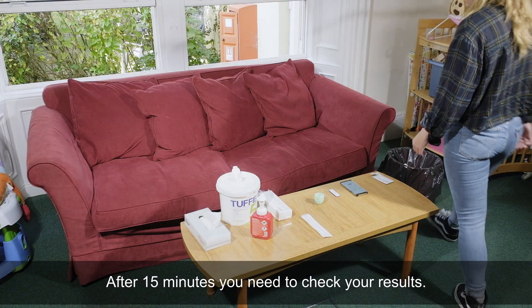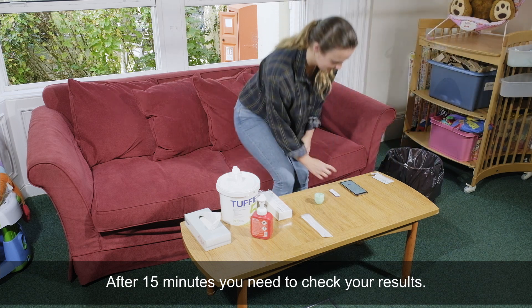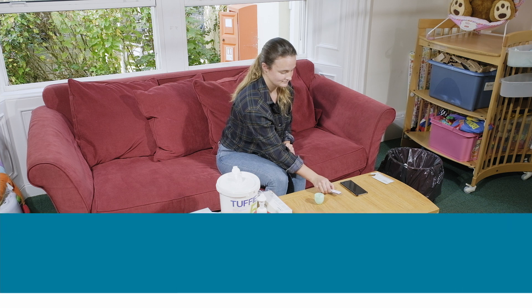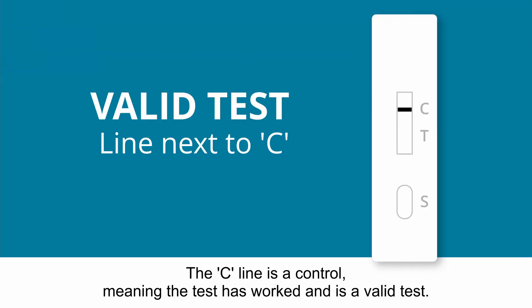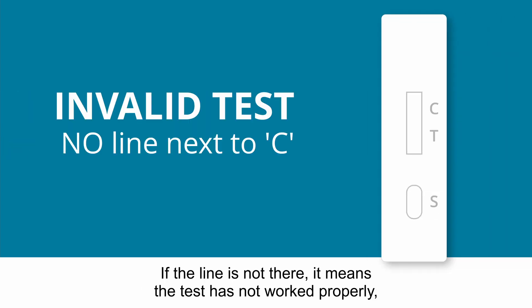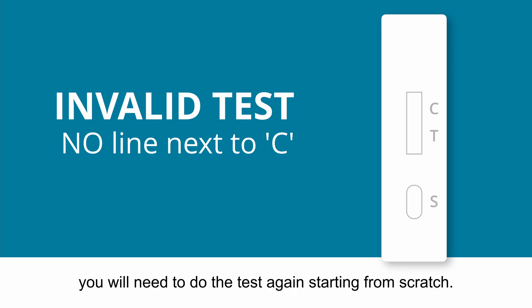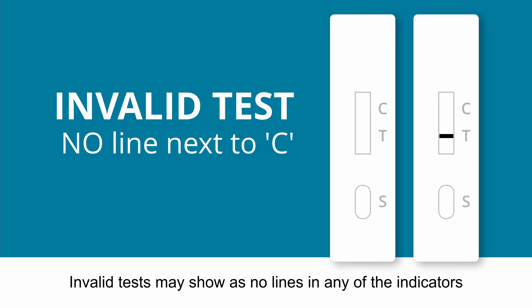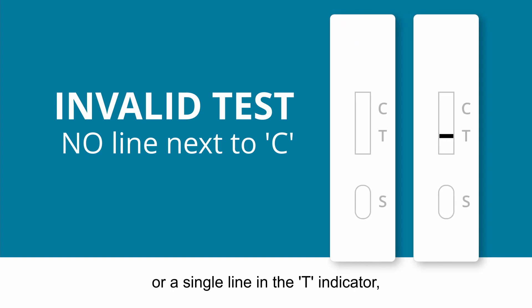After 15 minutes, you need to check your results. There are three possible outcomes for this test. The C line is a control, meaning the test has worked and is a valid test. If the line is not there, it means the test has not worked properly. You will need to do the test again, starting from scratch. Invalid tests may show no lines in any of the indicators or a single line in the T indicator. These are all invalid.